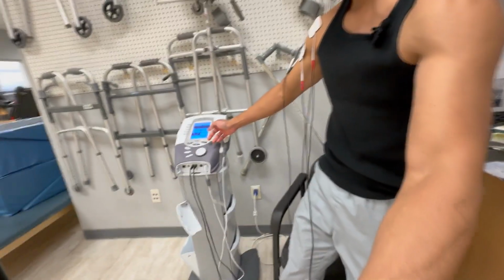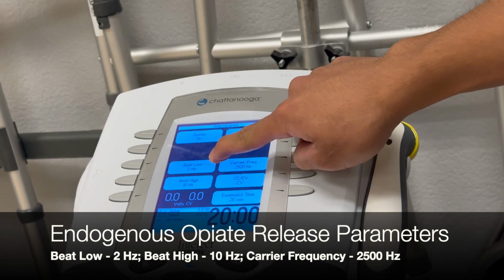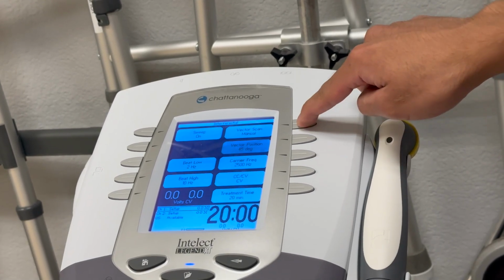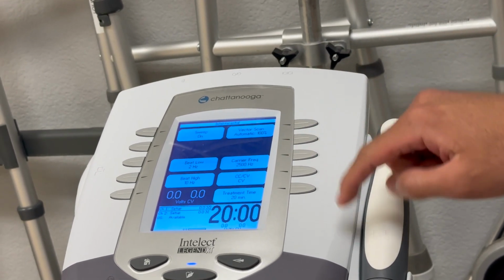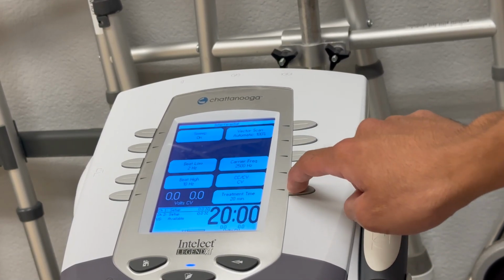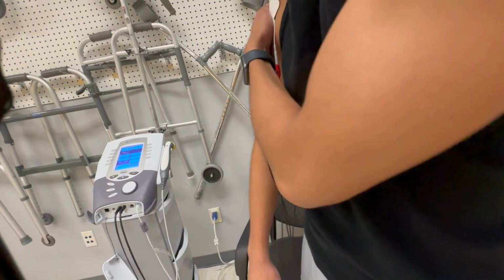And with the settings that I originally showed earlier, we're aiming for endogenous opiate release. Our beat low is 2 hertz, beat high is 10 hertz, carrier frequency is going to be at 2500 hertz, and vector scan, I'll go ahead and change that to 100%, so I can address more of a bigger area for treatment. Treatment time, I'll go ahead and leave that at 20 minutes. And now y'all will just watch me for those 20 minutes while I explain the rest of the details.